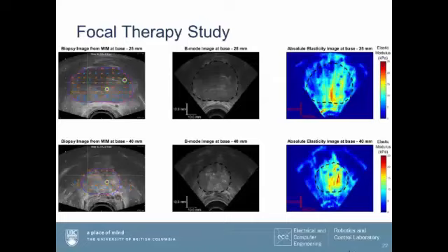You can see that the shape of the image is different, the scan conversion, and that's because our absolute volumes are 2D sagittal planes that are swept 90 degrees, whereas the biopsy images are taken from the transverse plane. So this is interpolated into a 3D grid and shown as the transverse slice. That's why they look slightly different in terms of the scan conversion.